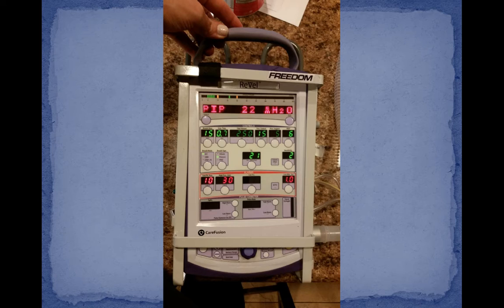You have a respiratory rate of 15, an I time of 0.7. Tidal volume is darkened out, so we're not working with tidal volume. Remember, we're in pressure control ventilation. A pressure control of 15 with a PEEP of 6, and it should calculate a delivered peak inspiratory pressure of 21, and it's measuring on the test lung a peak inspiratory pressure of actually 22 centimeters of water. You have a target PIP and then an actual PIP, and that's measuring your actual PIP.